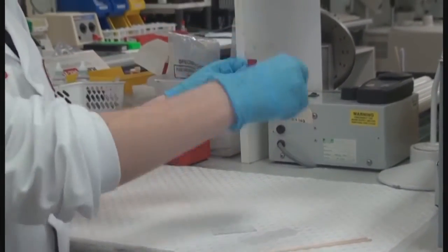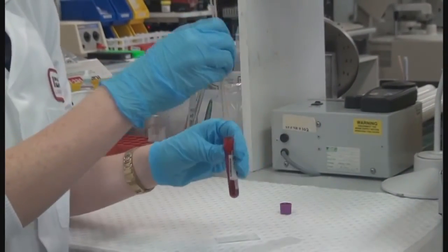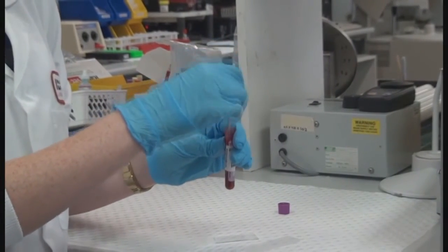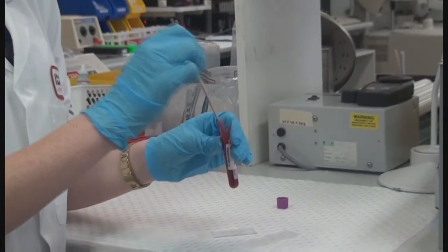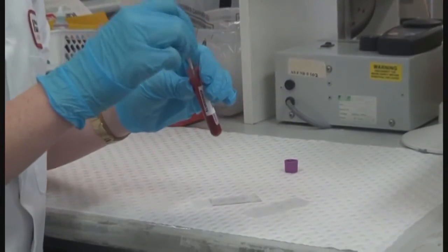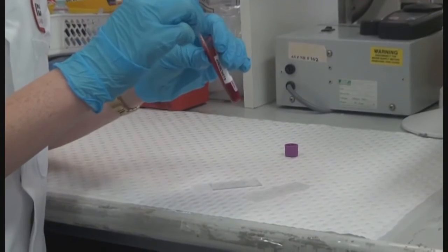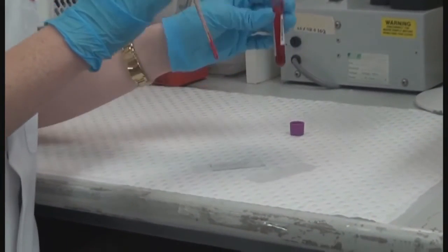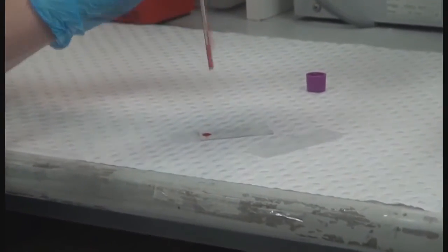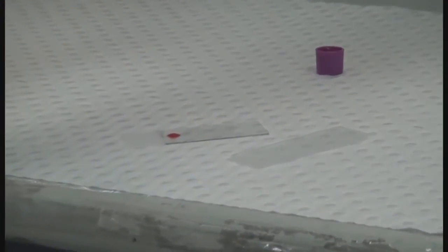Open the tube, and insert your applicator sticks. You want to give it a nice mix to check for any clots. Pull the sticks out. If there are clots, they will stick to the sticks. And get a nice drop of blood on the slide. Not too big, about that size.